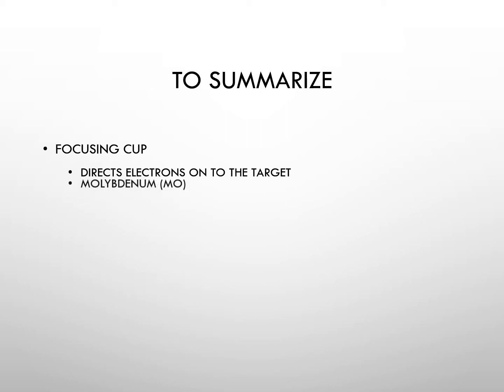To further summarize, the focusing cup directs and literally focuses the electron stream onto the center of the target, controlling the actual focal spot size. It is made from molybdenum, which is moderately heat resistant.